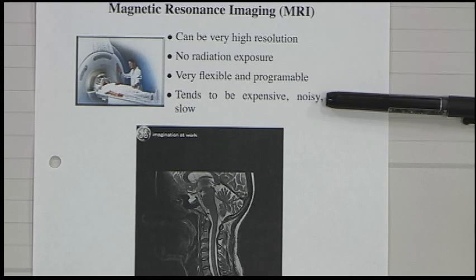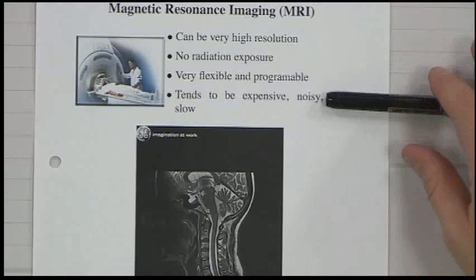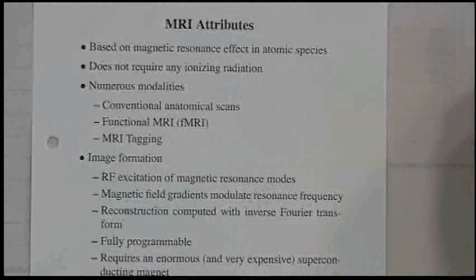But in some cases, it's more than just uncomfortable. It also can interfere with the measurements you want to make because the acoustic signal creates auditory stimulus of your auditory central nervous system, and if that's what you're trying to measure in a functional imaging modality, then that's a problem.